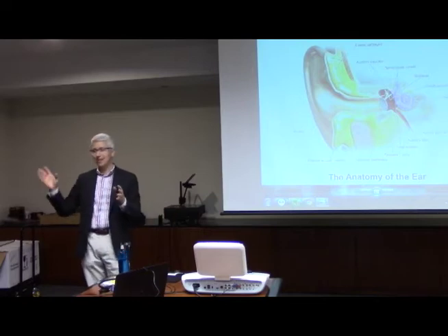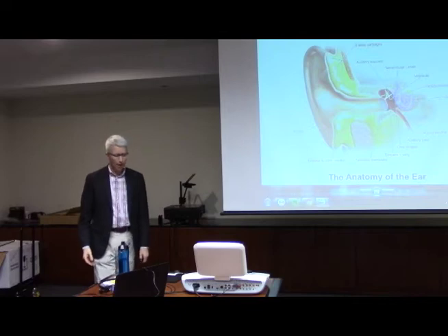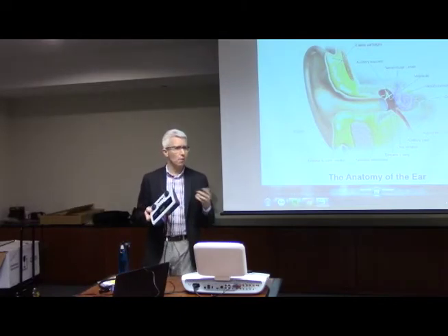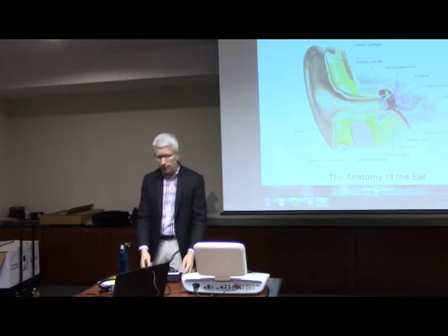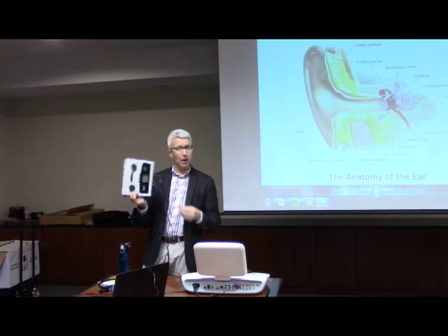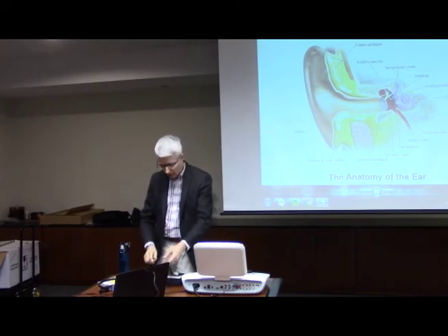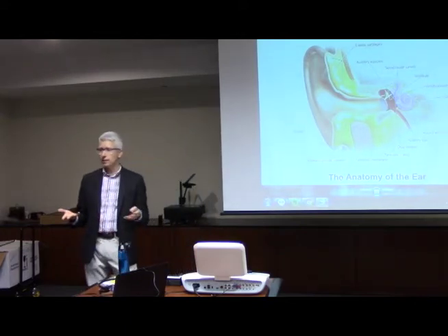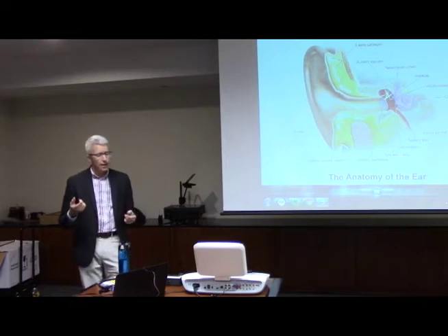And there are some that are probably 20, 30 years old still kicking out there when they first came out. Things are a little bit different now, but the more you pay, the more robust they tend to be for things like that. So this is considered a portable audiometer. Some of them are battery operated, like I said. Some of them aren't. A lot of them anymore are coming with a battery operated option. Electronics are just so much easier now to make things battery operated.